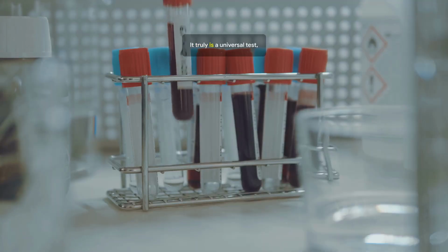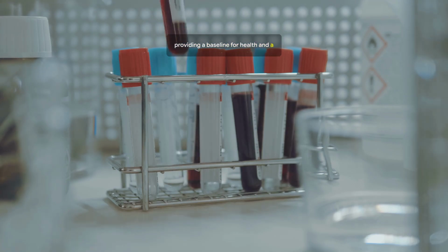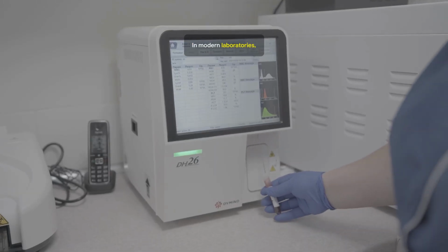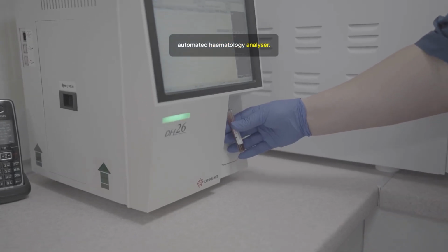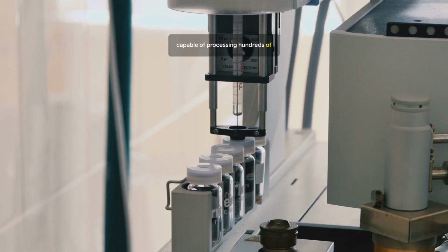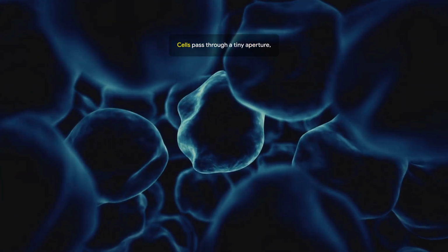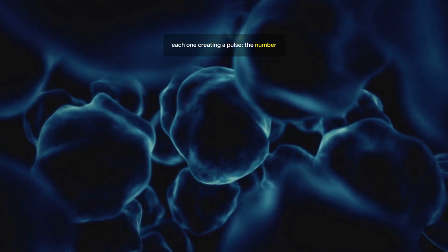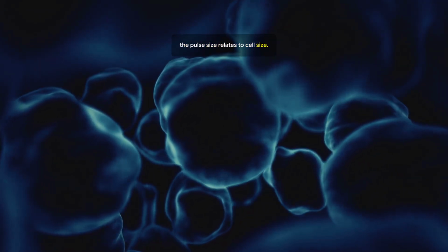It truly is a universal test, providing a baseline for health and a guide for treatment across all fields of medicine. In modern laboratories, the full blood count is performed by an automated haematology analyzer. These machines are fast and precise, capable of processing hundreds of samples every hour. First principle, electrical impedance. Cells pass through a tiny aperture, each one creating a pulse. The number of pulses equals count. The pulse size relates to cell size.